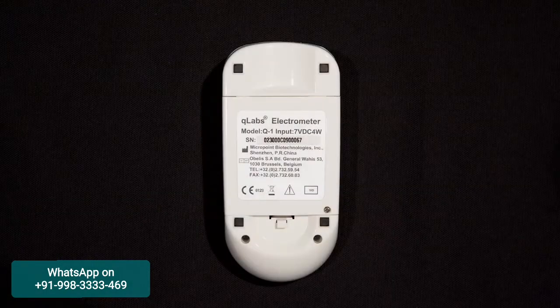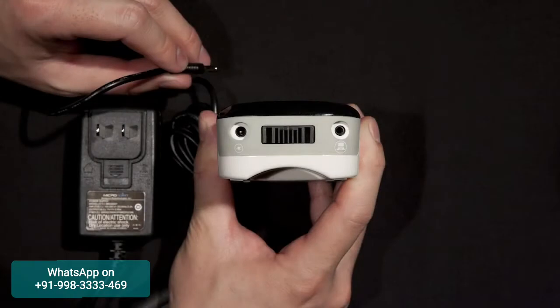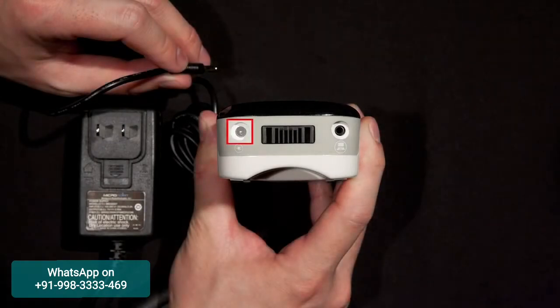On the back of the Electrometer, we have the battery cover, the battery cover screw, and the battery cover release. At the top, you will find the power supply jack and the data port.